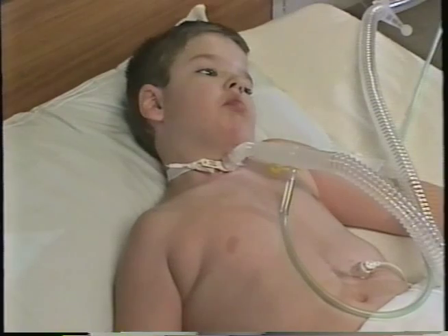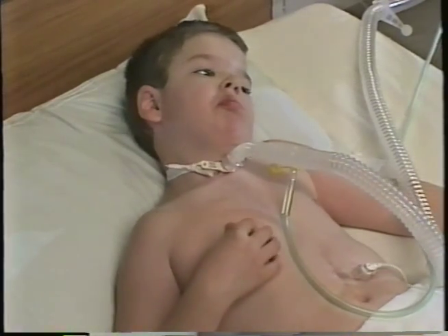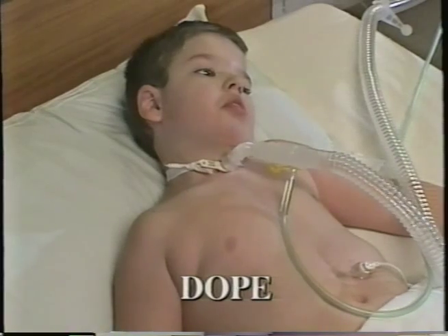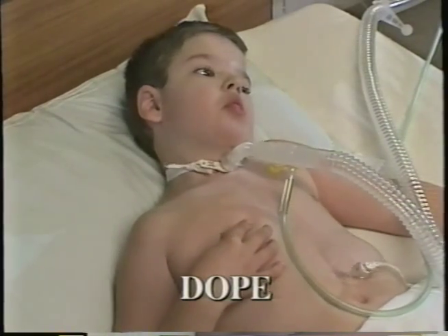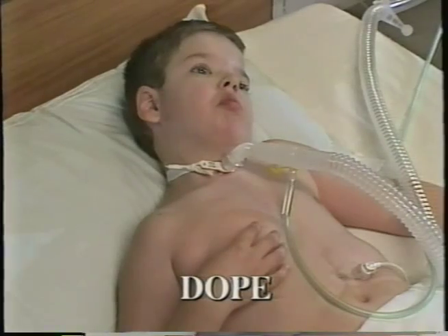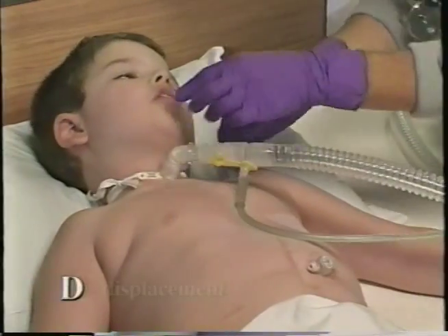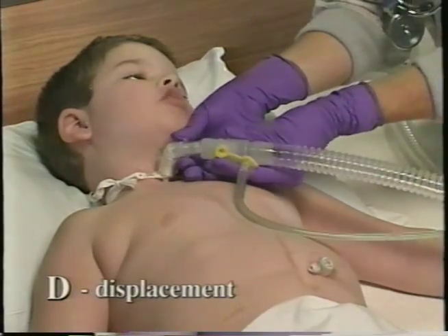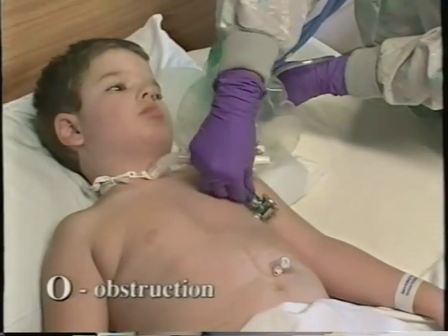If a child with a tracheostomy shows signs of respiratory distress, the DOPE mnemonic reminds the provider to check for the common causes of acute deterioration in respiratory status. D is for displacement. Is the tracheostomy tube displaced or disconnected? O is for obstruction.